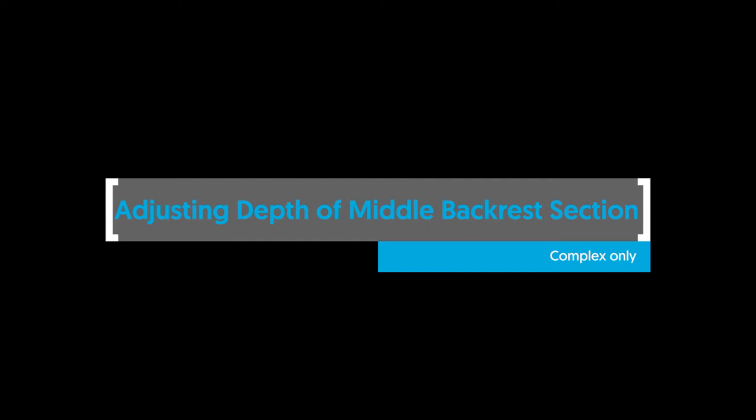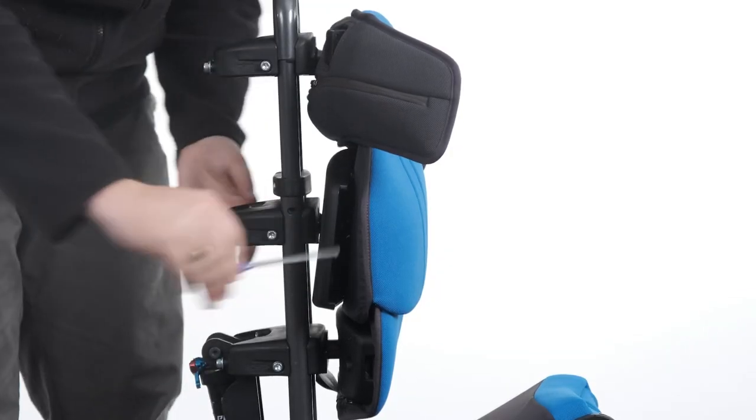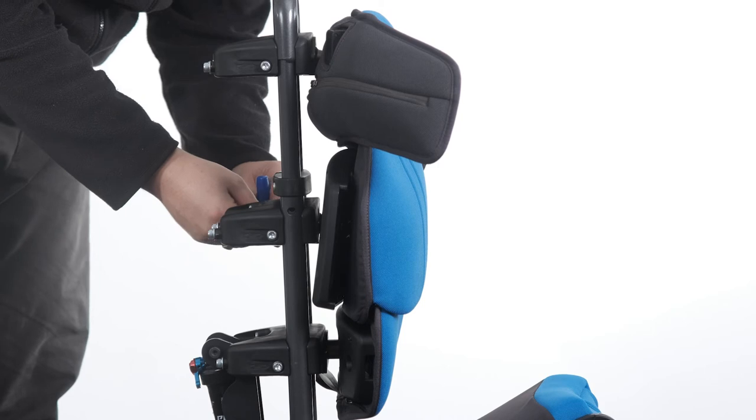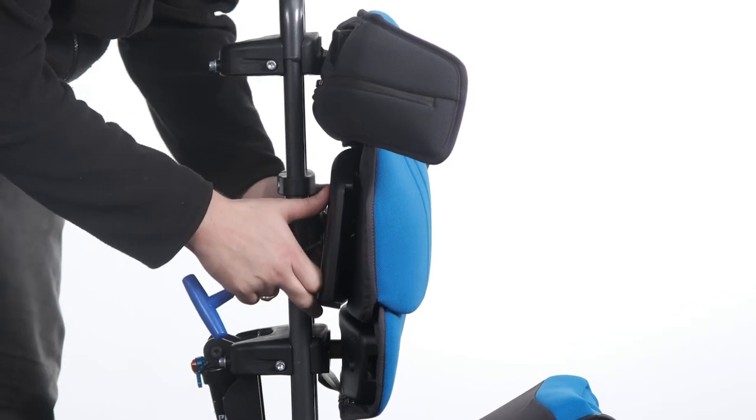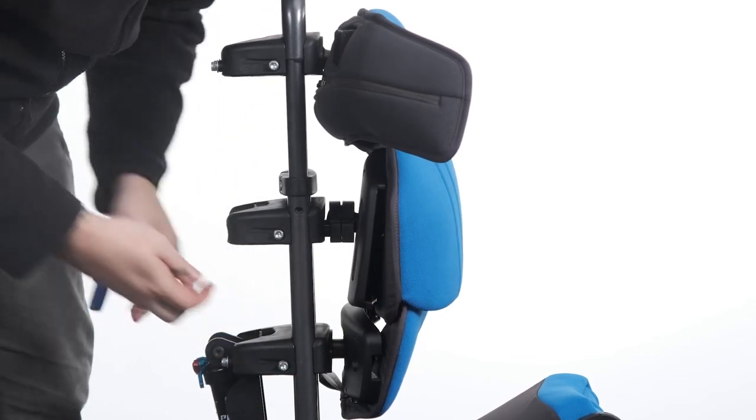Adjusting depth of middle backrest section — complex only. To adjust the depth of the complex clamp, loosen the bolt at either side of the clamp. Adjust the depth by moving the backrest section forwards or backwards to the desired position. Tighten the bolts to secure in position.